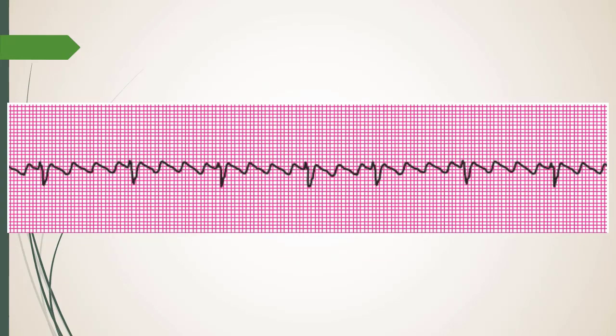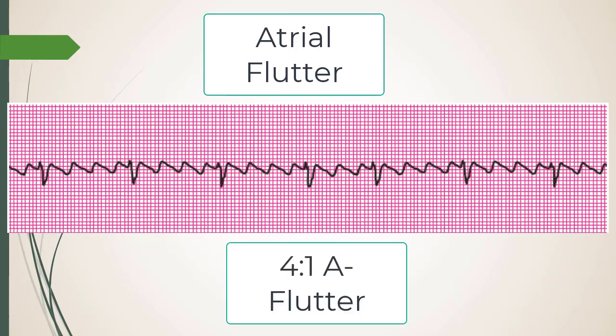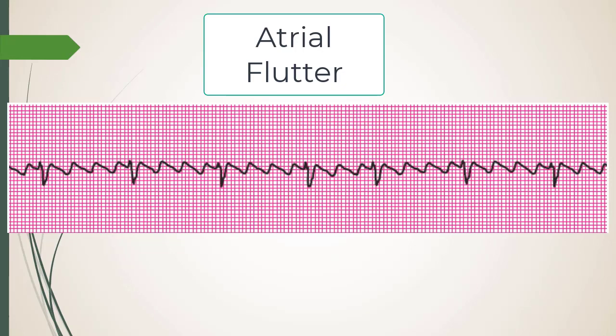Next rhythm — atrial flutter. You can see the classic sawtooth or shark-teeth pattern. Being in flutter means decreased atrial contribution to preload — not as bad as A-fib, but not normal. This looks like a 3:1 or 4:1 flutter. The narrower the conduction ratio and the closer to 1:1 conduction, the more unstable the patient gets.